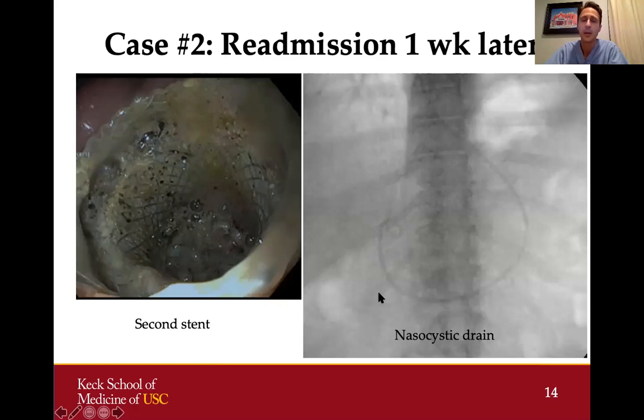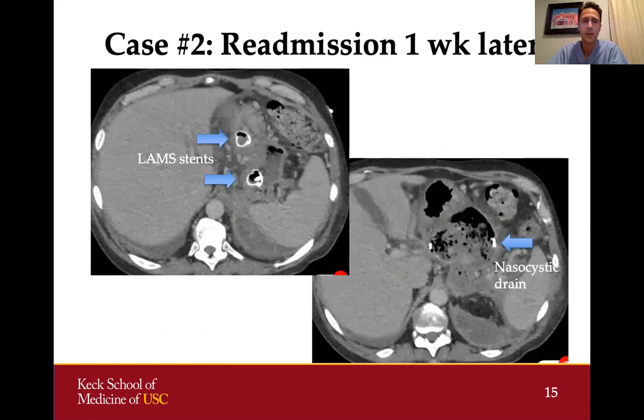The nasocystic drain allows us to flush the cyst cavity out with fluid. We left it in place for about a week and had the patient lavage the cyst with saline a few times a day to keep the cavity clean. A follow-up CT scan showed our two lumen-opposing metal stents and air in the cyst cavity as expected, as well as the nasocystic drain coiled in the collection. Importantly, the cyst cavity was already getting a lot smaller.